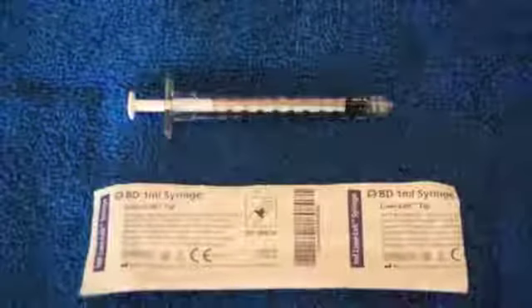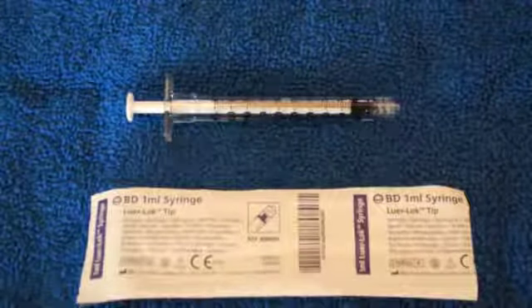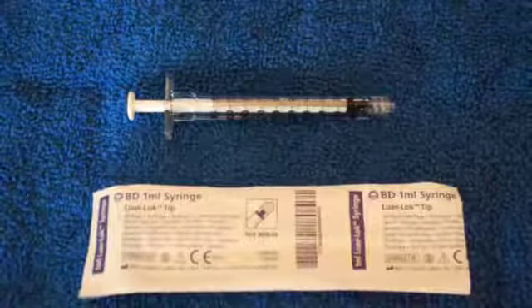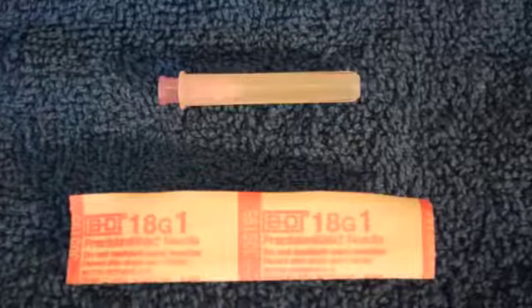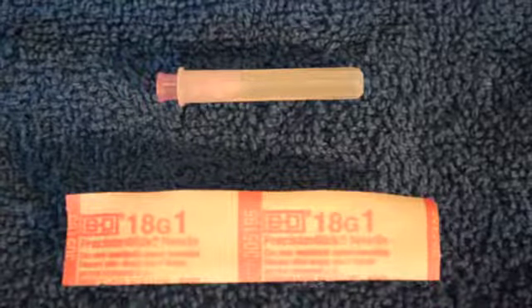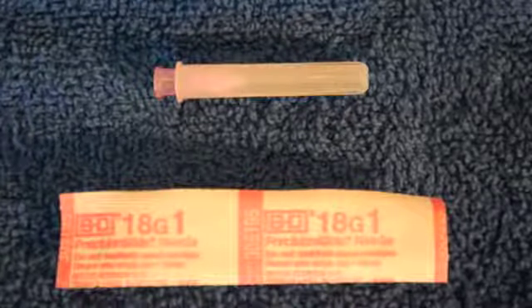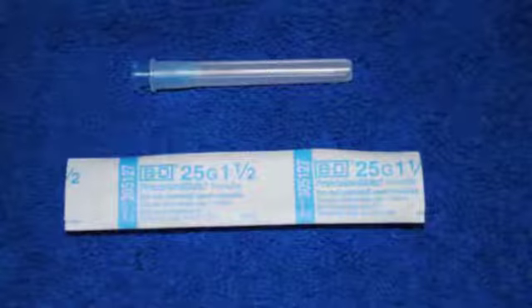The most convenient syringe to use is a 1 milliliter lock syringe. Here it is shown both in the package and outside the package. Always make sure that there is no damage to the sterile packaging with your syringes or needles. An 18 gauge needle is used to withdraw the testosterone from the vial. Here it is shown both in the packaging and outside the packaging. Again, be sure the packaging has not been damaged. Do not use this needle to inject with.